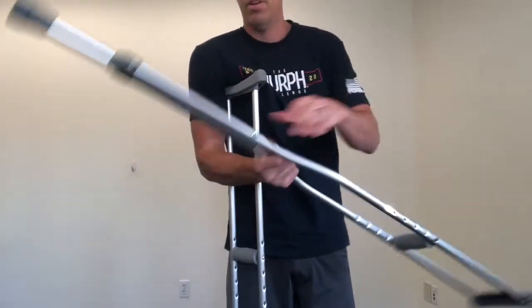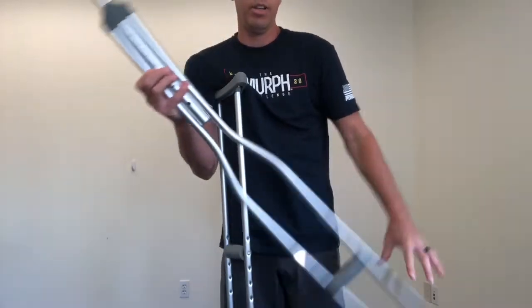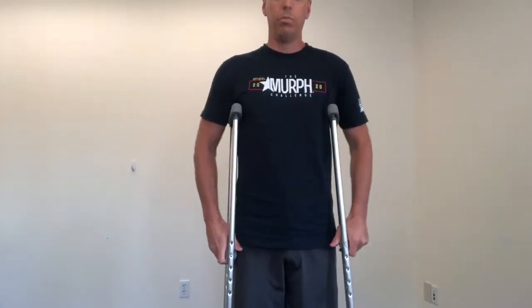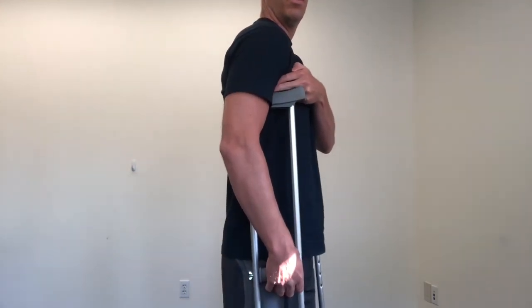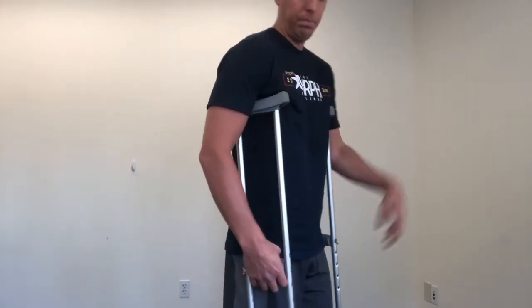Then do the other one, same thing — make sure you hear that click. Crutches by your side, stand up tall, and now I have two finger widths in between the crutch and my armpit, and that's what you want. So you have the proper height of your crutches.